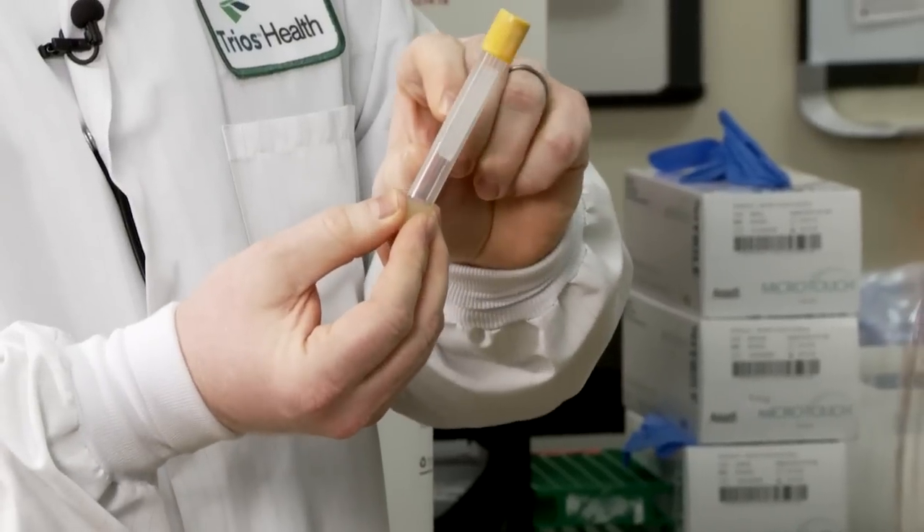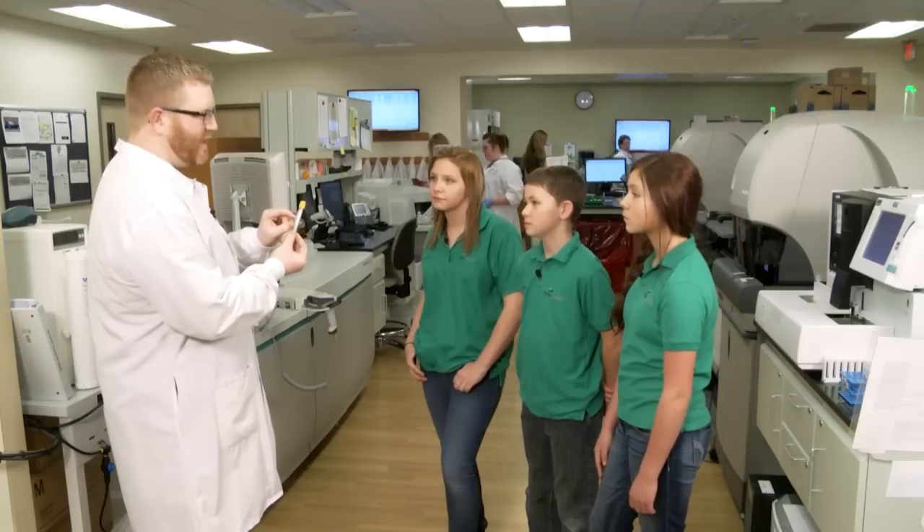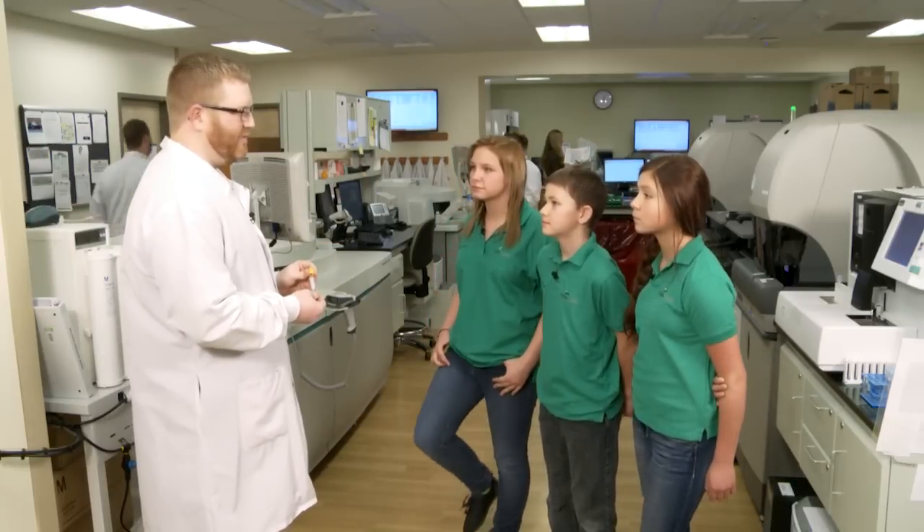When it does that, the cells all come to the bottom and we're left with just the liquid part up at the top. So then we can test different things on the liquid part of your blood. We can test things like glucose — you know what glucose is? Sugar. Yes, glucose is sugar, and we can see how much sugar is in your blood to check for things like diabetes.